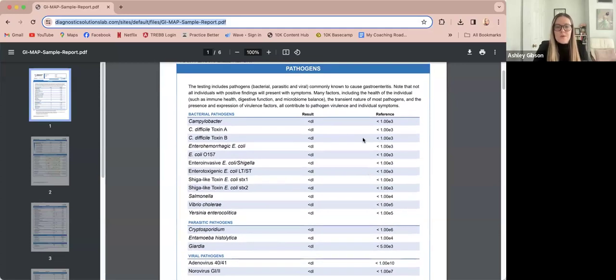I'll be honest, there's only a small handful of functional tests on the market that look for these things, and this is by far the most superior. It is my absolute favorite, and I've tried a couple different ones over the last several years. So let's dive right in and take a look at what we would see on this test. I'm going to be sharing my screen with you. Let me just pop this up. This is a sample report that we are going to go through today.